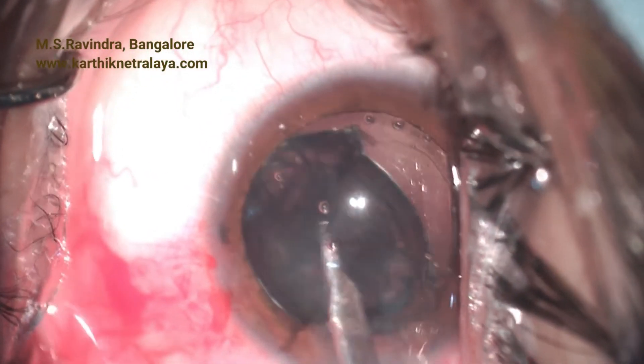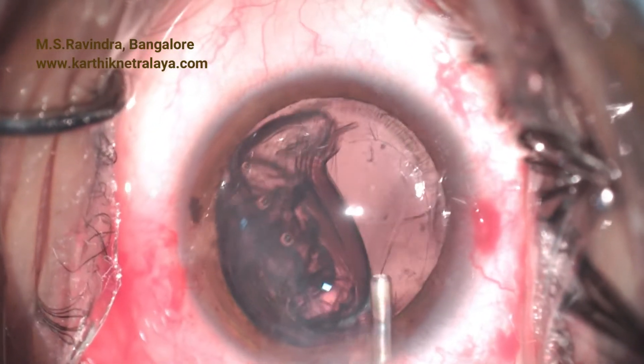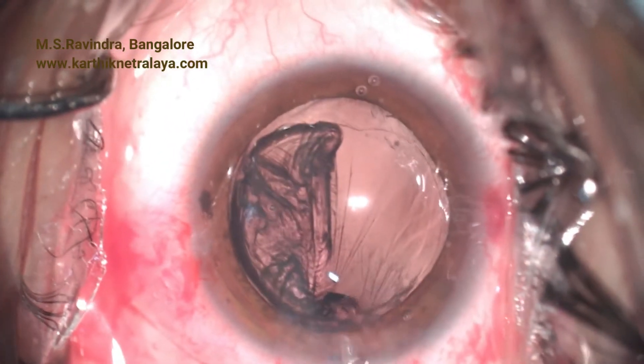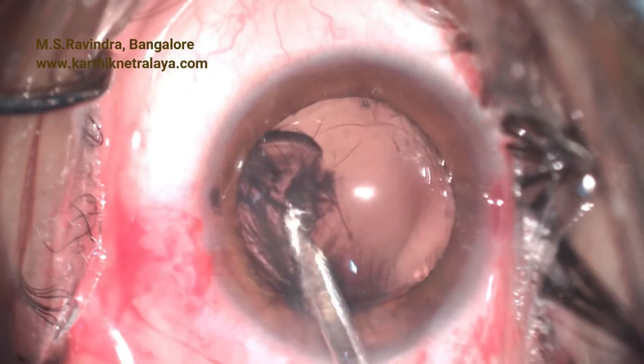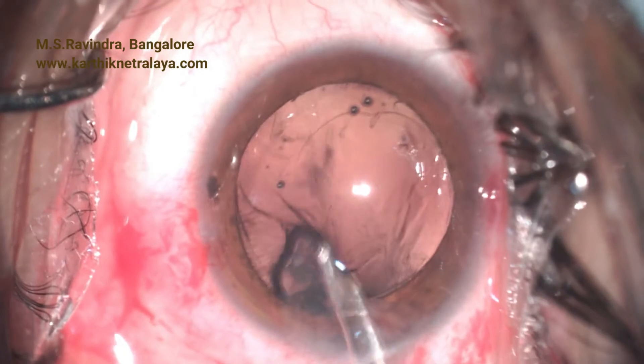There are a couple of options for IOL implantation: one is scleral fixation of a lens, or anterior chamber IOL implantation. I preferred the implantation of an iris claw lens which is fixated on the back of the iris. All the cortical remnants are aspirated gently.